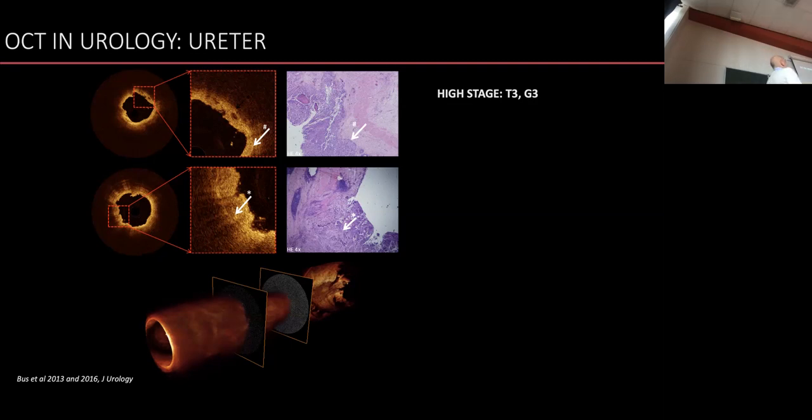And suddenly we were able to do that with an OCT system like that. Now, I said before, we used to get in with this tiny forceps. And the problem with that is you again have this waiting line for the pathologist before you have an answer. But also taking the tissue is quite dangerous. You yank it out, you cut it out, and you can create holes in this tube and create tumor spillage, cell spillage, and that kind of stuff you don't want. So here, OCT has a really big benefit of offering a minimally invasive diagnosis of ingrowth.